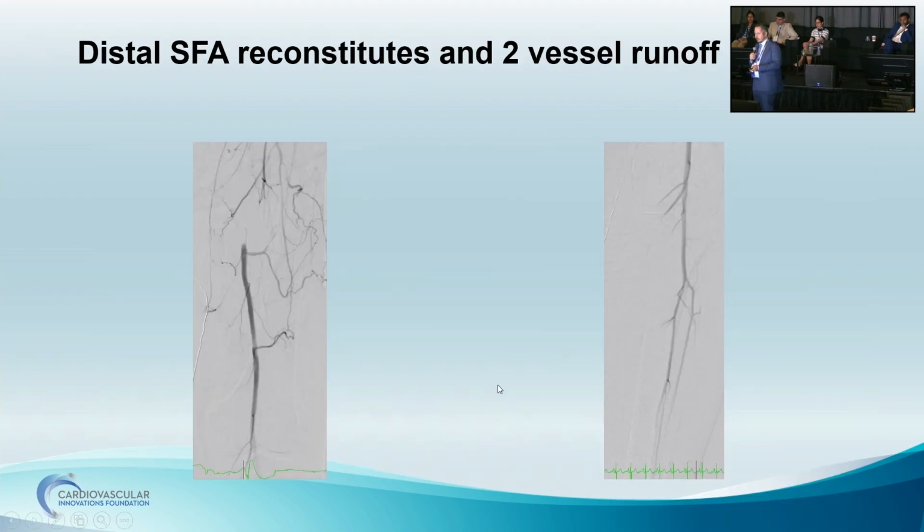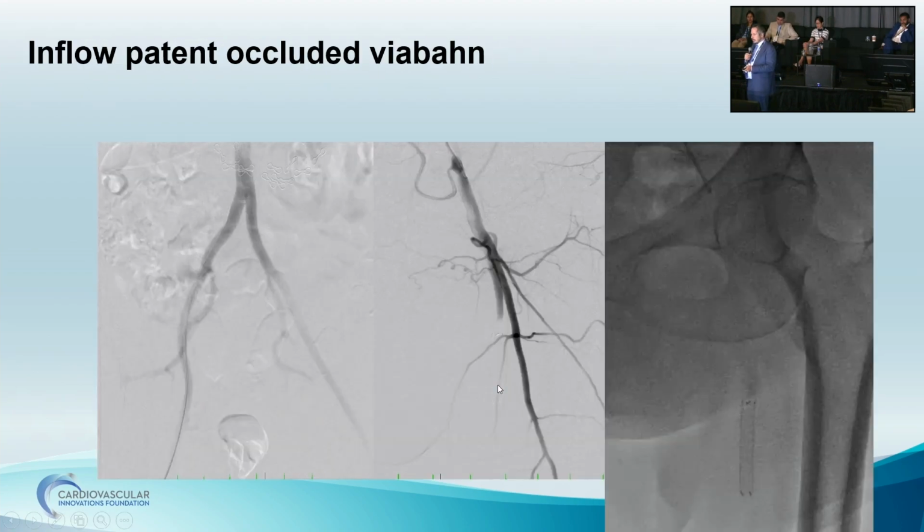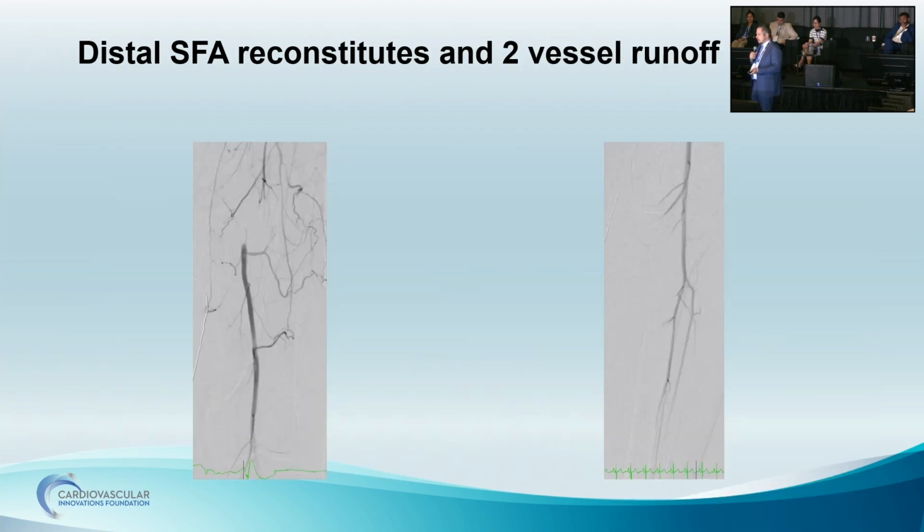Okay. So you can see this acute occlusion, but what I want to point out is the middle segment, how you see the contrast is just slowly hanging in there. That is a sign of a thrombus after that lesion. So usually the rule of thumb is you try to avoid balloon angioplasty in this situation. So they crossed this lesion, they put a filter. Unfortunately, they went ahead and ballooned.